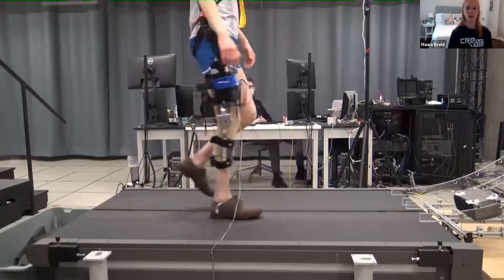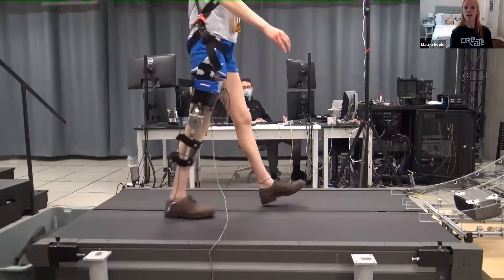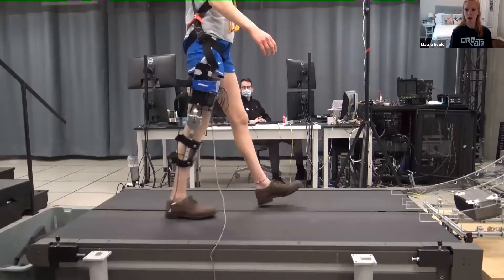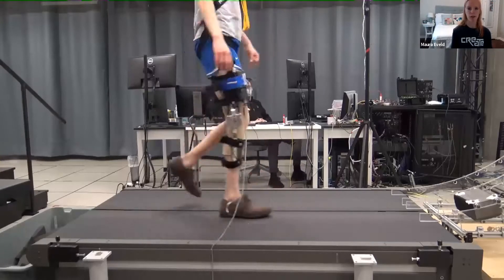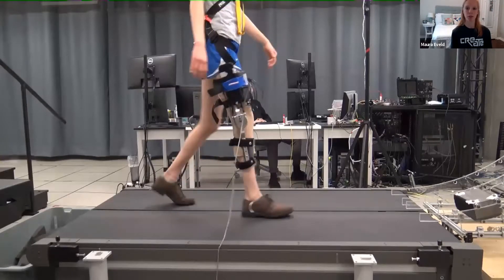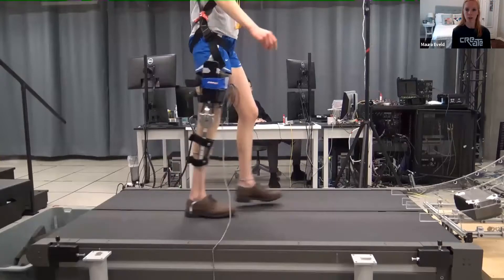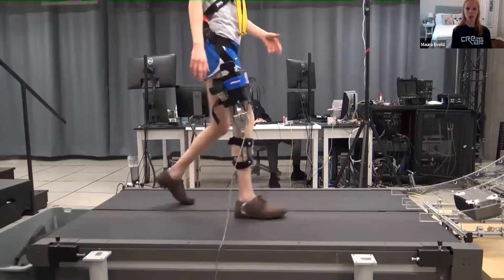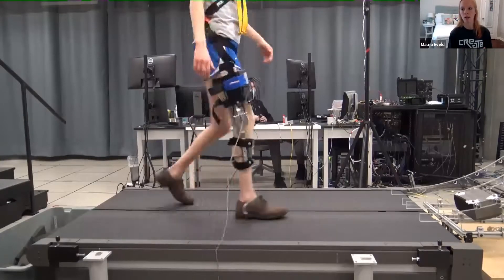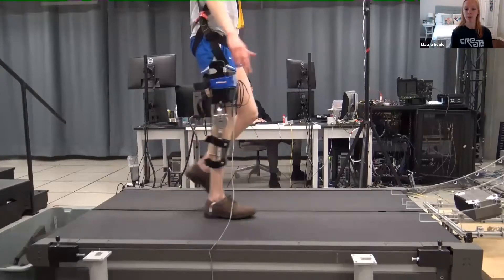Lastly, here is another example of a lower limb exoskeleton, this time designed for just one joint — the knee — on just one side. This type of device is used for individuals with gait asymmetries, meaning they might have muscle weakness on one side due to a stroke or other condition. The motor at the knee joint can help the user bend and straighten, allowing them to adopt a healthier and safer walking pattern.